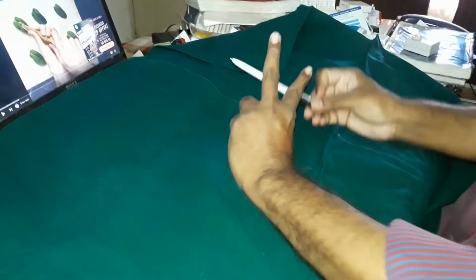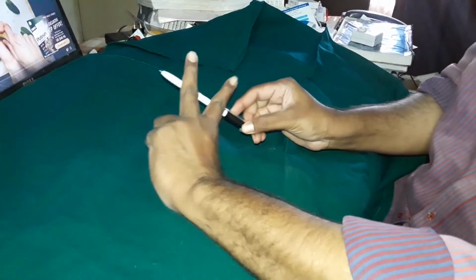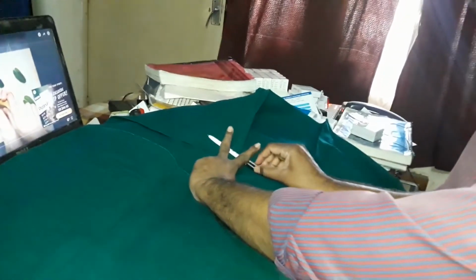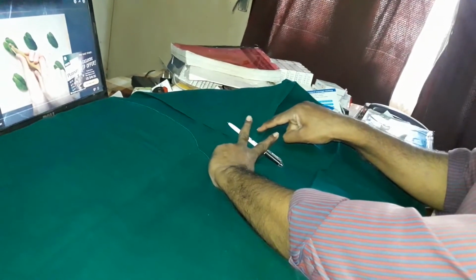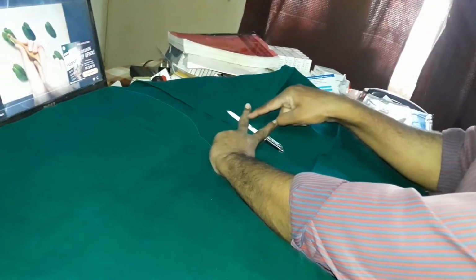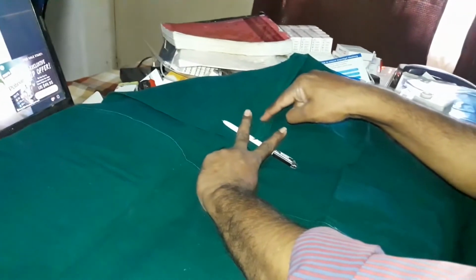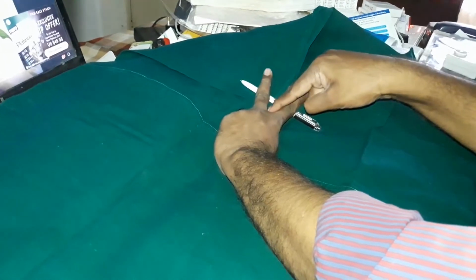See, like this. Here this is the chordal crest. The upper space, this chordal crest divides the facial recess into upper space and lower space. Always one cell is present in this upper space and the lower space is bony.